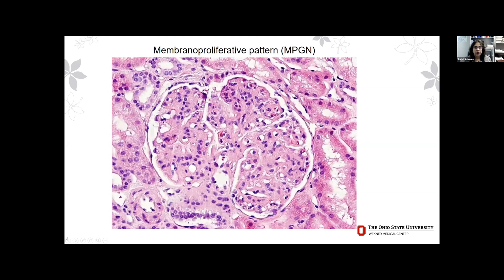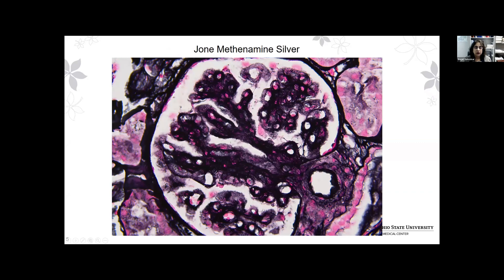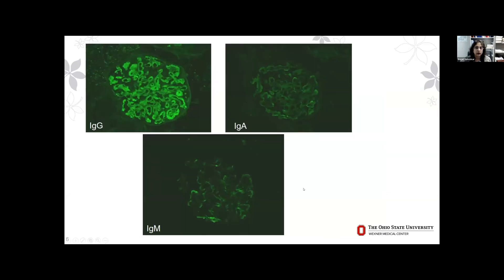The biopsy showed a membranoproliferative pattern of glomerular injury with enlargement of the glomeruli, mesangial and endocapillary hypercellularity, and nodular lobular accentuation. There were no crescents, no necrotizing lesions, no interstitial inflammation, and no interstitial fibrosis or tubular atrophy — mainly diffuse glomerular involvement. On silver stain, you can nicely see the GBM thickening; there may even be a few spikes associated with membranous change. As Dr. Sethi described, repeated episodes of injury and healing cause the GBM to thicken, showing duplication and remodeling, which we will see better on electron microscopy.